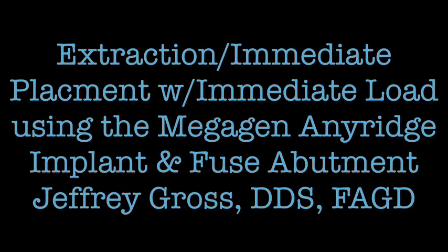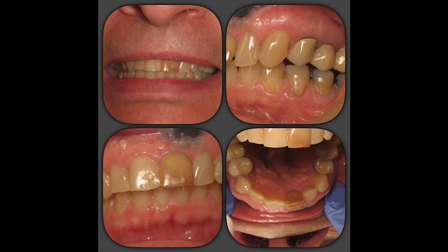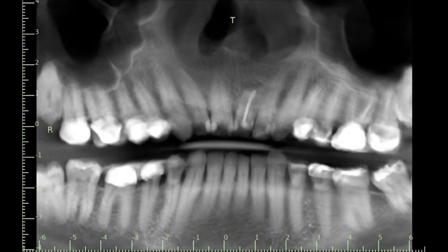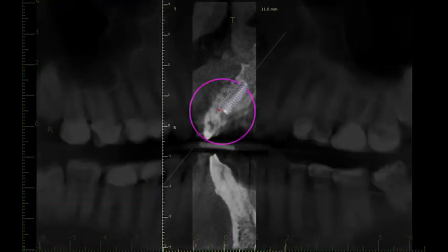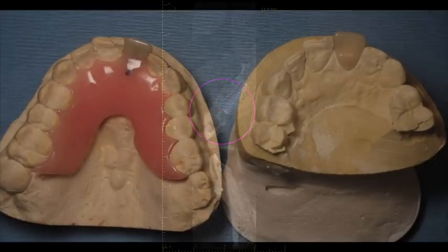Today's patient is a 68-year-old male with a failing tooth number nine. This tooth has previously been treated with endodontic therapy followed by multiple apicoectomies over the years. One can see the amalgam tattoo from previous apicoectomies years ago. The patient presented with a feeling of difference in his upper front tooth around the gingiva. Upon examining the gingiva, it was noted that there was a loss of stippling. When the area was probed, a significant probing depth was recorded. A CT scan was taken and implant planning proceeded.